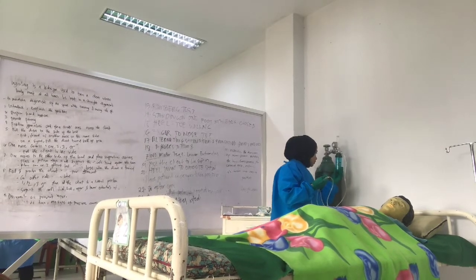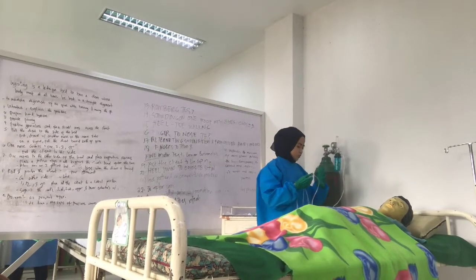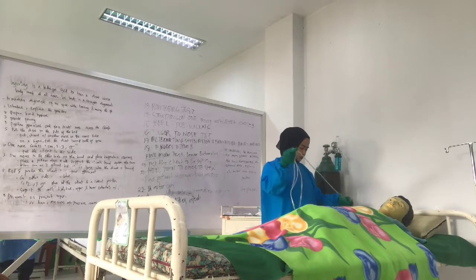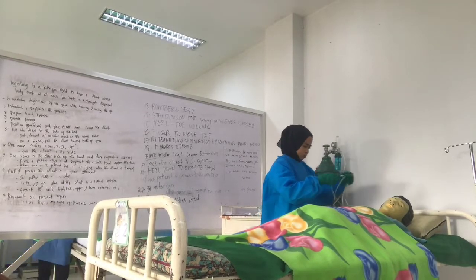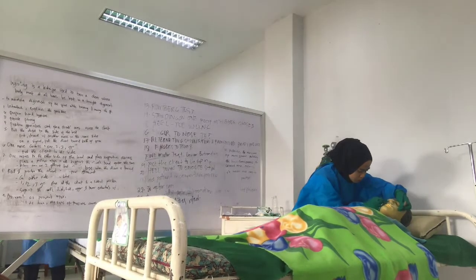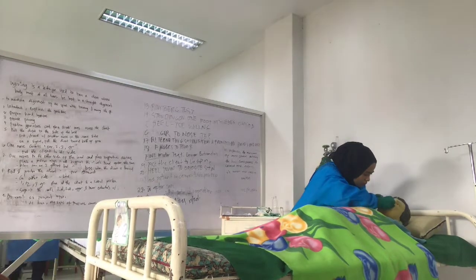Apply the appropriate oxygen delivery device. This is to administer supplemental oxygen to the client. Using cannula. Put the cannula over the client's face with the outlet prongs fitting into the nares and the tubing hooked around the ears. Adjust the fit of the tubing by sliding the adjuster upward to hold the cannula in place.